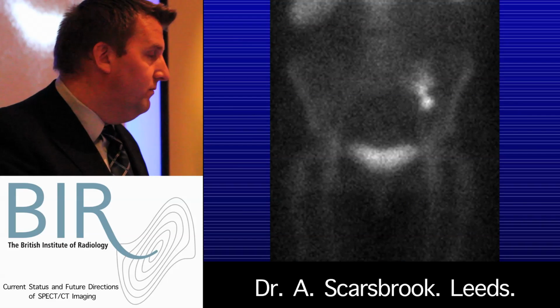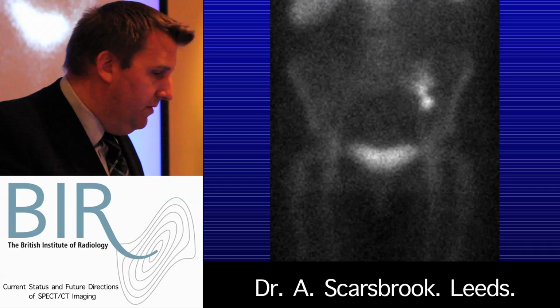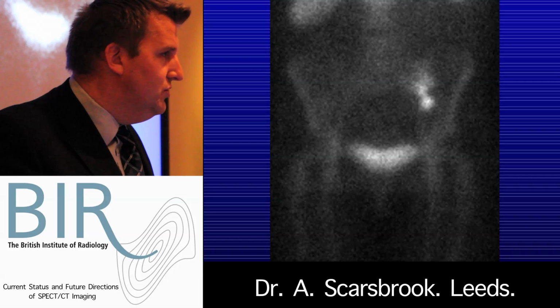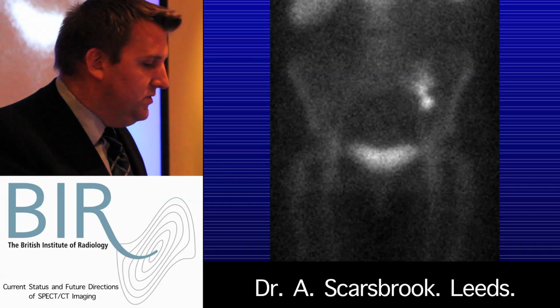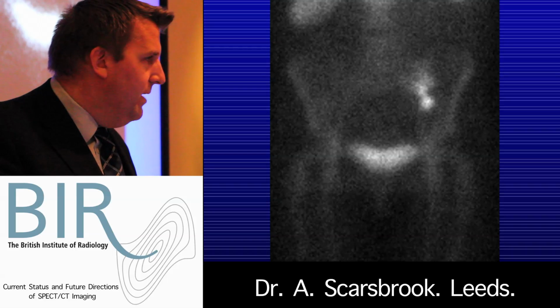And here's an example from the early days with a hybrid camera in our department. This was a Friday afternoon scan. A patient from a DGH had been referred centrally with a fever of unknown origin. We didn't have any prior imaging. This was the planar image. You can see there's focal uptake there in the left side of the pelvis.